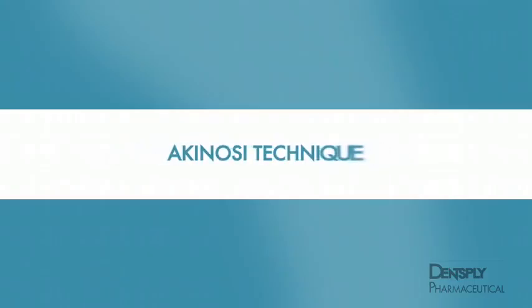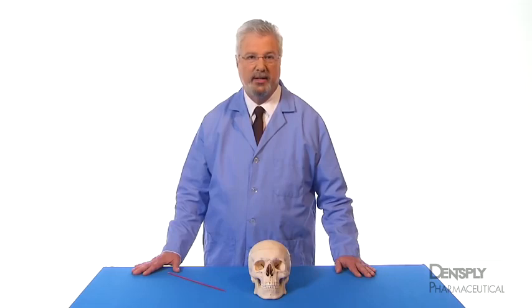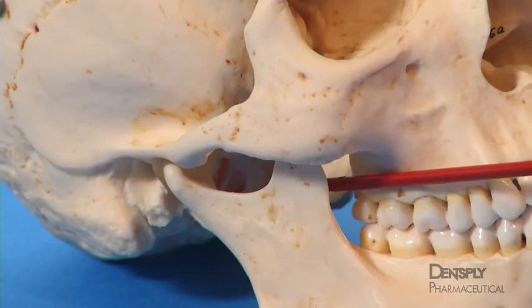Akinosi technique. The closed mouth approach to mandibular anesthesia, or Akinosi technique, uses the cleft between the ramus and the maxilla in order to access the pterygomandibular space. Although the target for injection is not well identified, there being no bony contact to indicate proper insertion depth, the needle ends up in the pterygomandibular space somewhat superior and medial to the standard inferior alveolar nerve block.